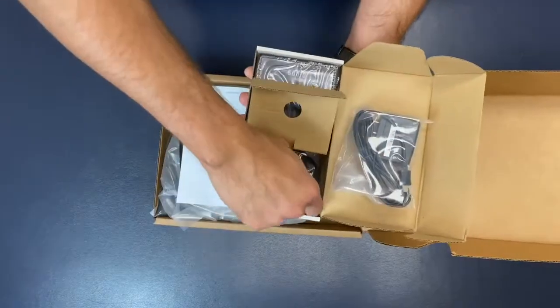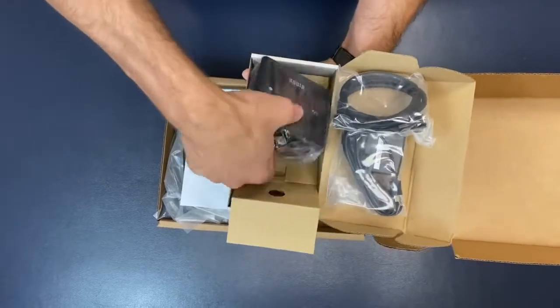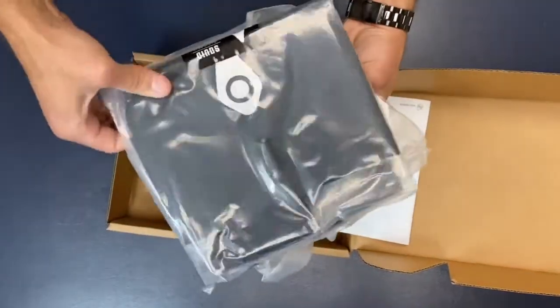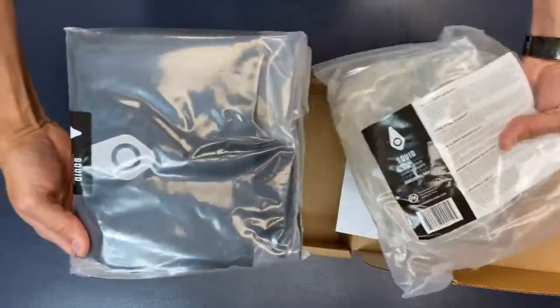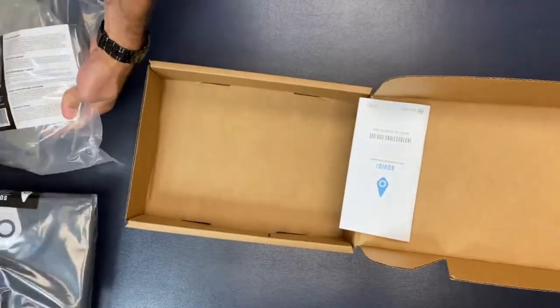In the box you will receive a Squid Go control unit with a charger and connector tube, either a left or right shoulder wrap, and a shoulder gel pack. I have received a right shoulder wrap.